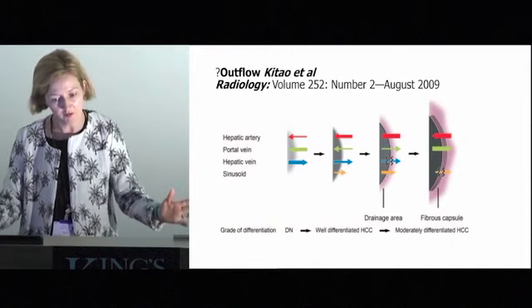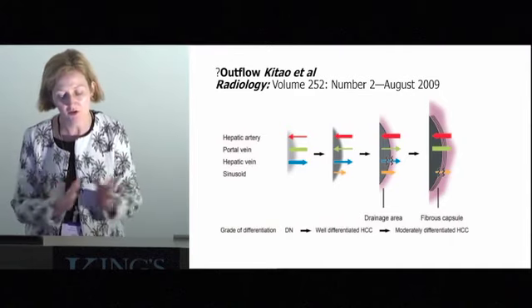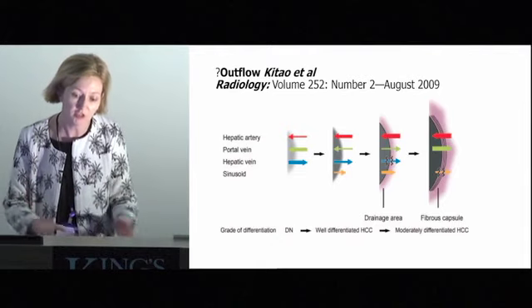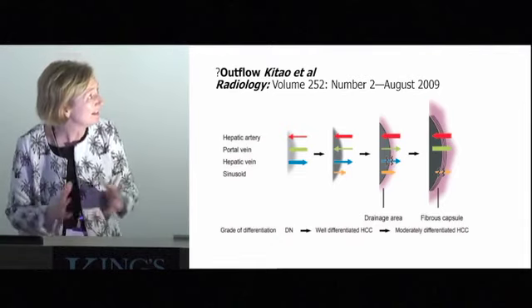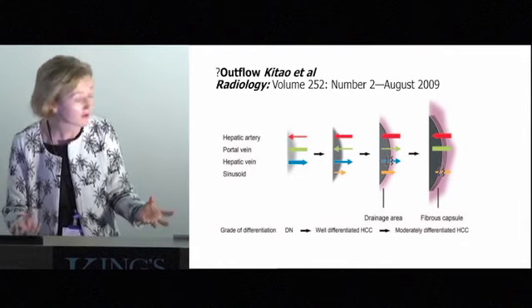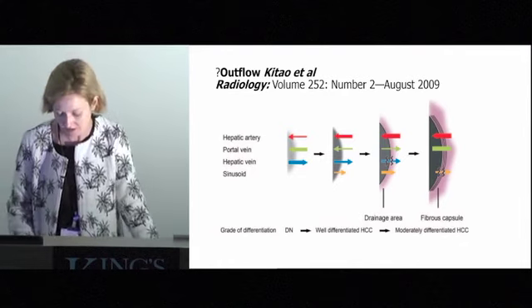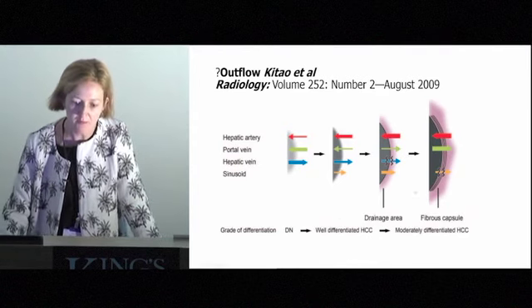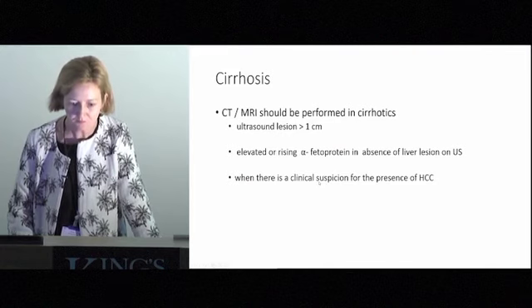And we've seen a similar flow diagram in the last chart, just showing us that it's all to do with the vascularity of the lesion and the tumour invasion of the nodule, ultimately eating up the portal venous flow and the hepatic venous flow so that you get arterialization at the end at your cancer stage and hypovascular on the portal venous phase. But it's a bit in between that we are trying to catch.